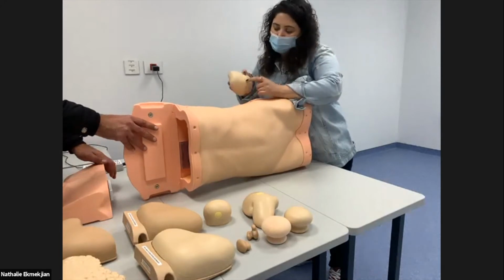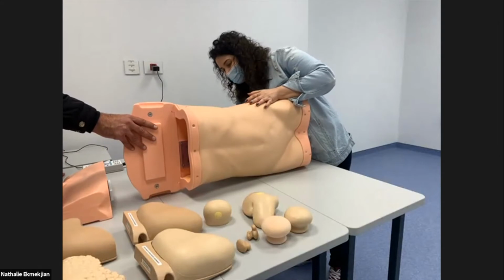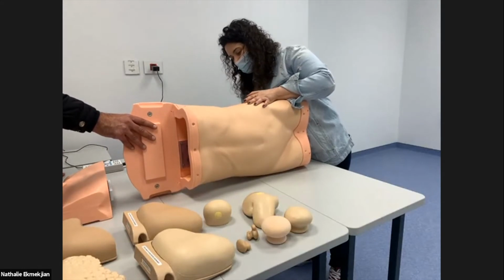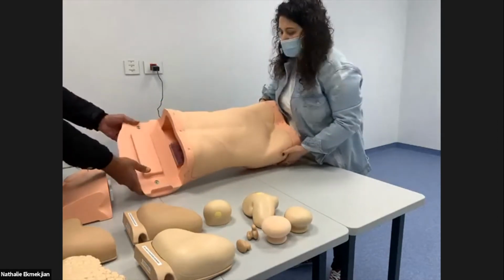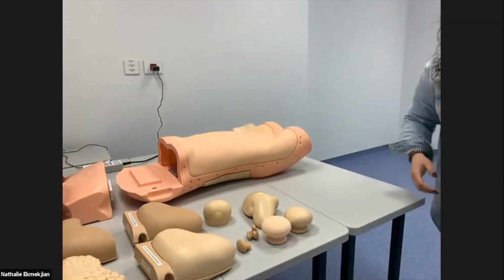So the button up and the arrow at that position. Okay. Let's put the liver.